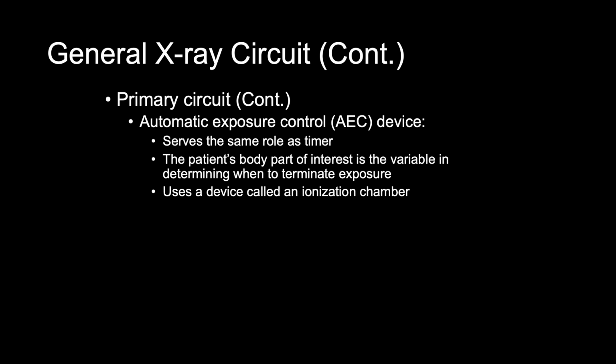The AEC can be adjusted or calibrated so that more or less of a charge is needed before the signal to terminate the exposure is sent. The AEC calibration is performed by the installation personnel, so we have nothing to do with that.